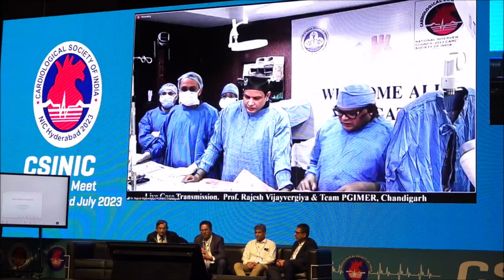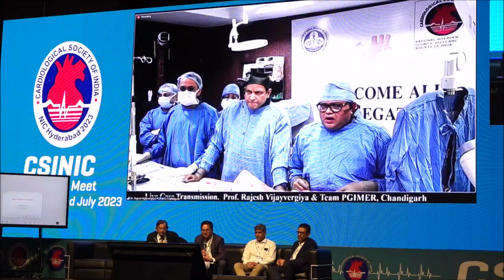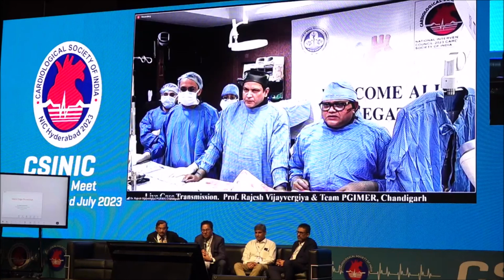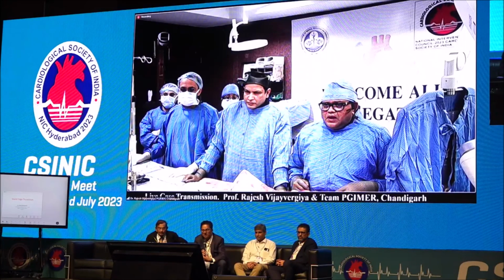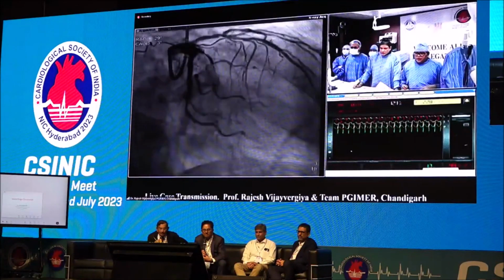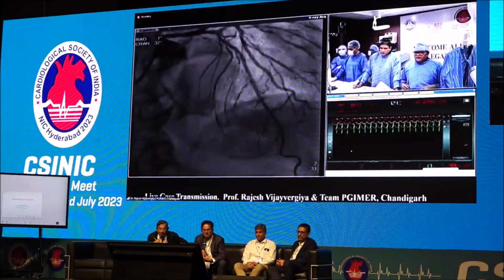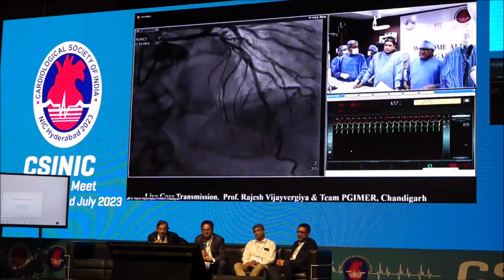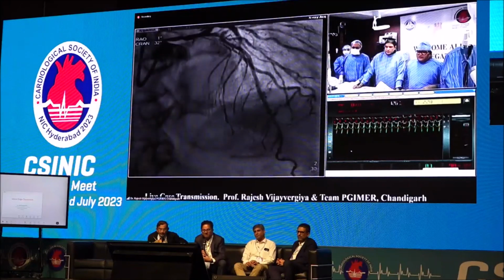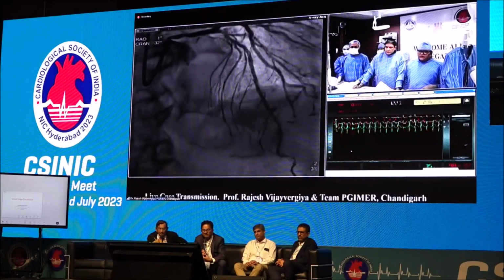Rajiv Jahar from New York. So please call this Medina class, what, 001 or 011? It's a 011. So do you think the ostial LAD is involved? See, it's around 70% disease across the LAD, and we are not sure about it, though the mid LAD does have a significant lesion. It's a bifurcation point over there. And can we have the first view, second view. Okay, and you can very well see the bifurcation site of the left main. There is a lesion, and therefore it's 111. But then there is a need to assess the LAD, which is around 70%. Ostial LCX, of course, is very significant.